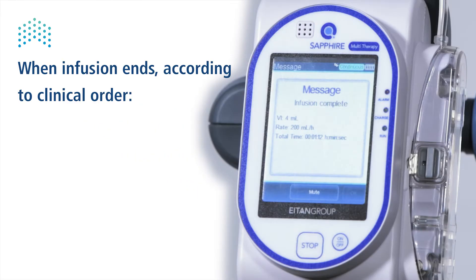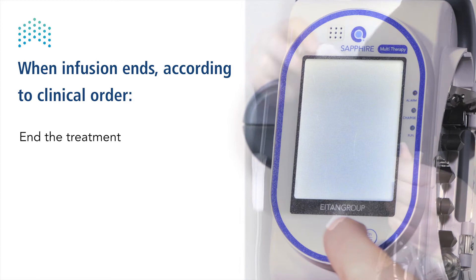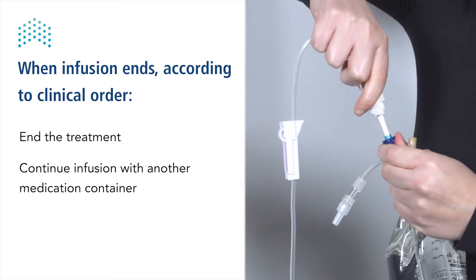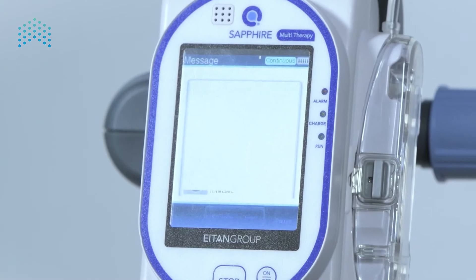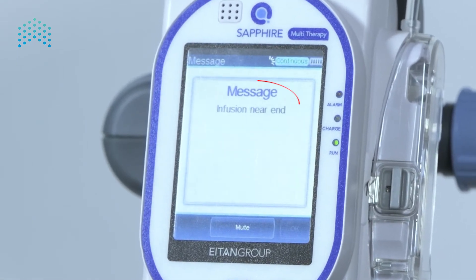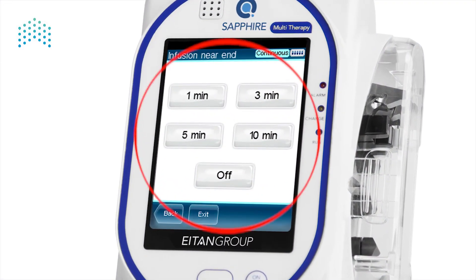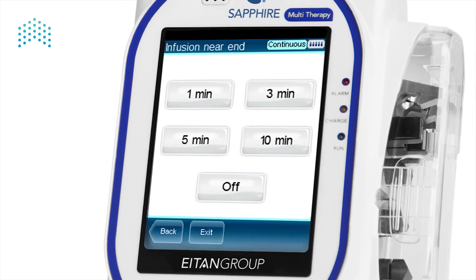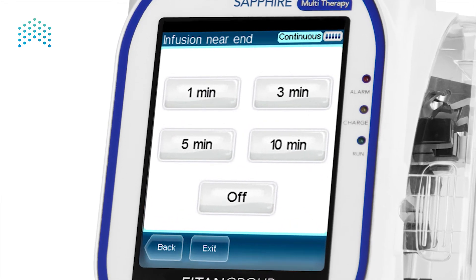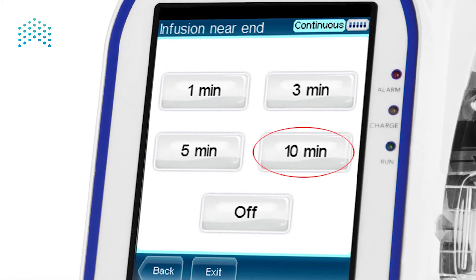The pump alerts when the infusion is done. According to the clinical order, either the infusion ends, or another medication reservoir should be connected to continue the treatment. To allow preparation time, the pump can be set to alert when the infusion is coming to an end. The alert signaling the infusion is approaching the end can be set to different timings — for example, to alert 10 minutes before the infusion ends. The SAFIRE pump alerts 10 minutes before end of infusion.